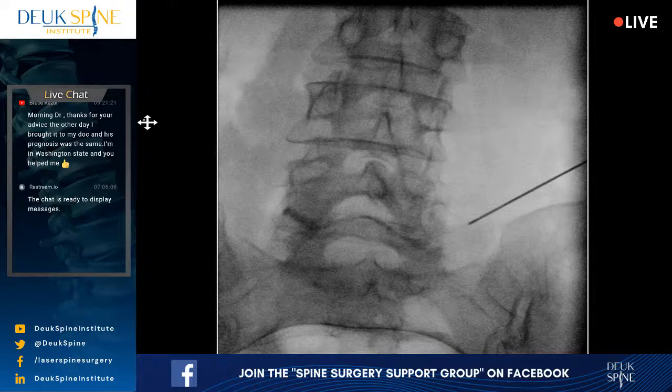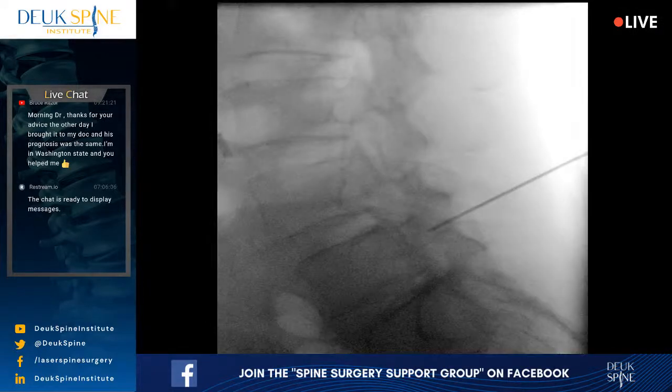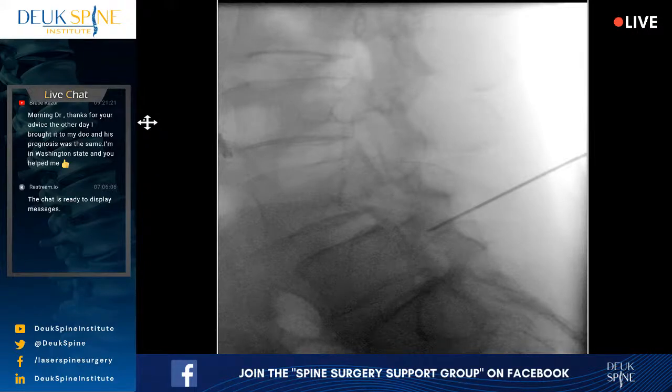So you can see there's some twisting of her spine. You all see that on that AP view we just shot? It's going off to the right. It's got a curvature to the right. And of course, that's not what we're here to fix today. We're not going to fix scoliosis today.